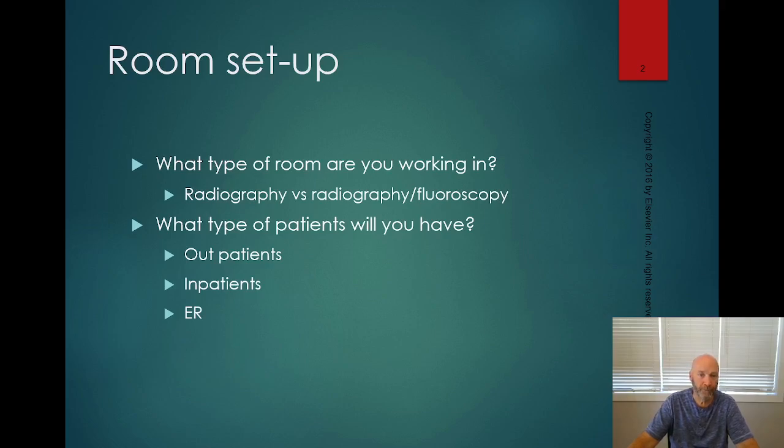So your room setup, the things that you need to consider for your room setup is what type of room are you working in. There are a lot of different types of x-ray rooms. Even within a specific type of x-ray room, there are different exams that you may see in each one of those rooms. So what type of room are you working in? Are you working in a radiography room, or are you working in what we refer to as an RF room, which is radiography and fluoroscopy? So what type of room are you working in?